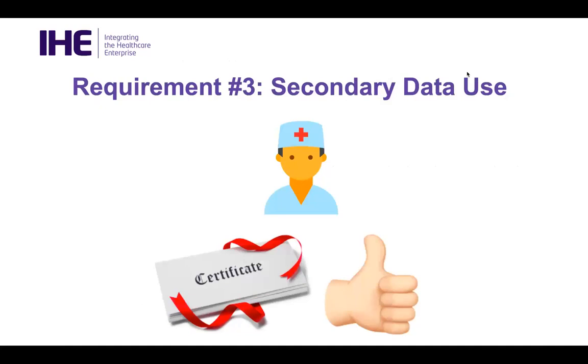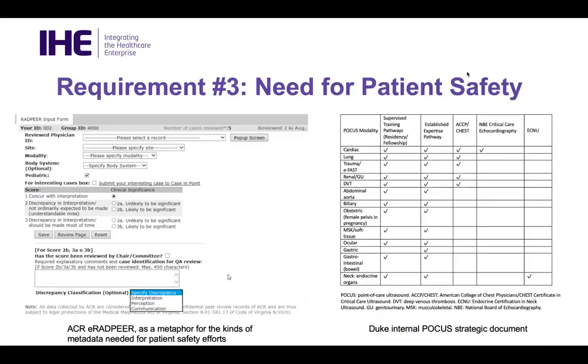I want to get a CME course put into place at my institution because I am qualified to teach this now. And lots of these reasons are why the body part specific piece of metadata is important, because as you're capturing a point of care ultrasound or an endoscope procedure, you assign body part and now it's in the background, and you can use that metadata for how many procedures did I do of that body part. So capturing all of it is vitally important, not just for regular patient care, but also because we need to prove that we are doing a good job to the hospitals that we work for, and increasingly to payers and consumer groups who want to define providers into those who are doing a great job and those who may still need a little bit of help.